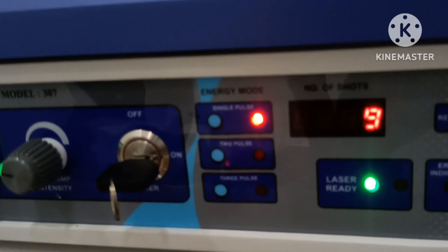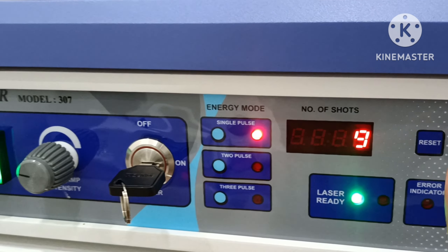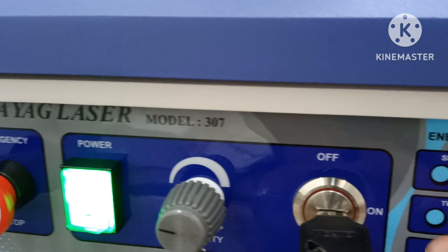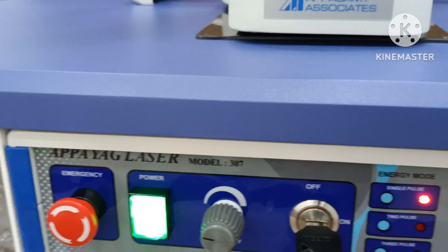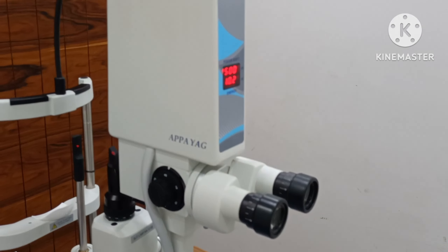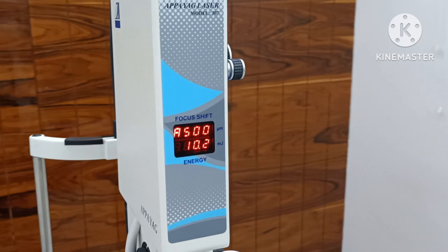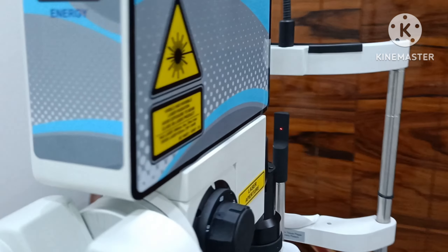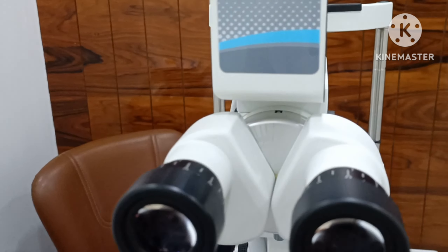Okay, beam trigger. Focus, number of shots, count reset. 2 pulse, 3 pulse, single pulse — available.